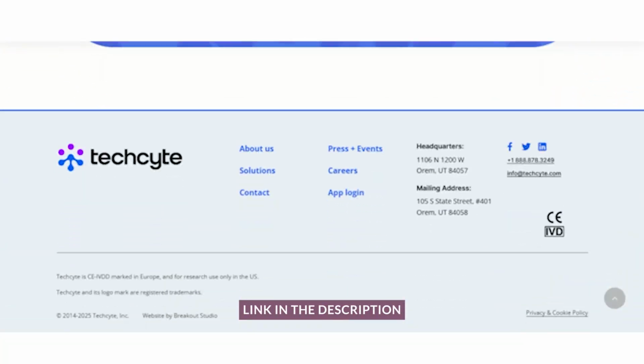Awesome. Looks pretty intuitive to me. Yes. Even not being so intimately familiar with the workflow, I was like, oh, okay, you click here, you click there. Easy to use. Yes, we hope it's easy. We hope it's intuitive. That's been our plan all along.